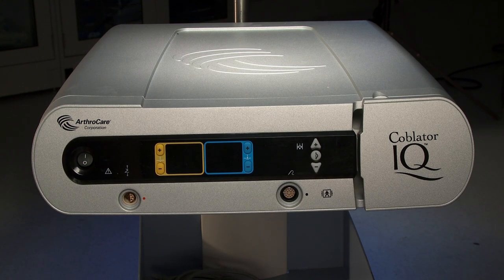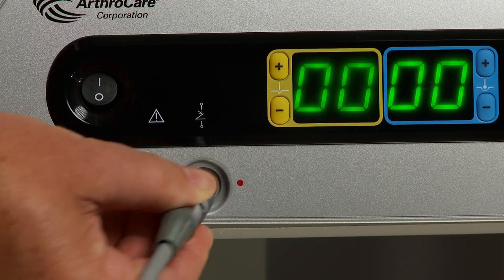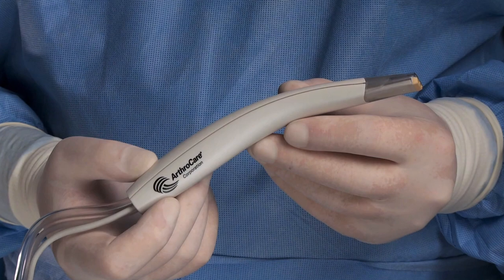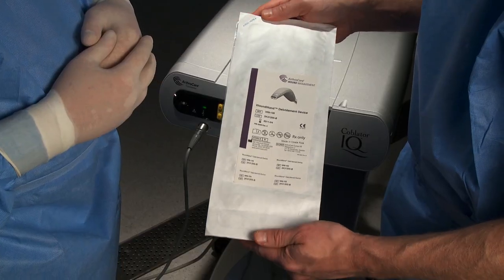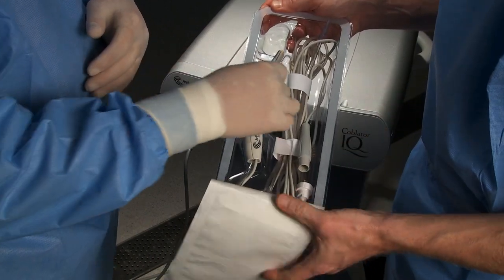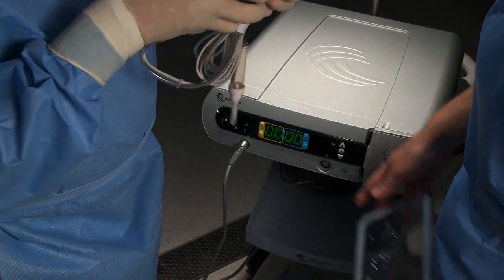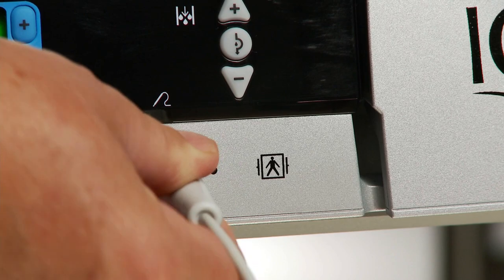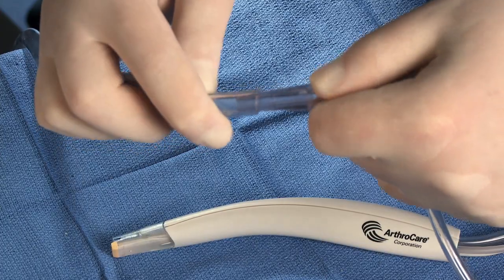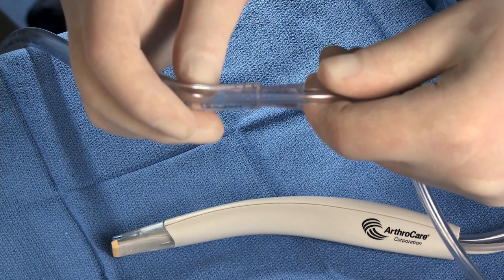To begin the procedure, turn the Coblator IQ or CIQ controller on and connect the foot control to the controller receptacle. The Wound Wand debridement device is a disposable product, provided in a sterile package, and is indicated for single-use only. Remove the Wound Wand debridement device from its sterile packaging and connect the handpiece cable to the cable receptacle on the controller.